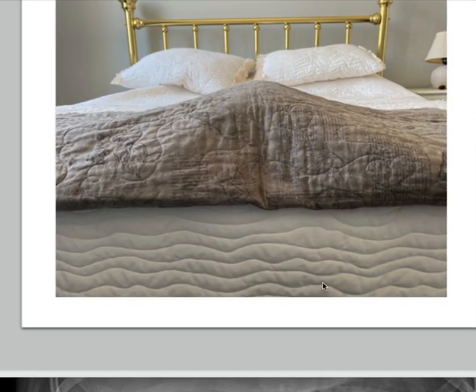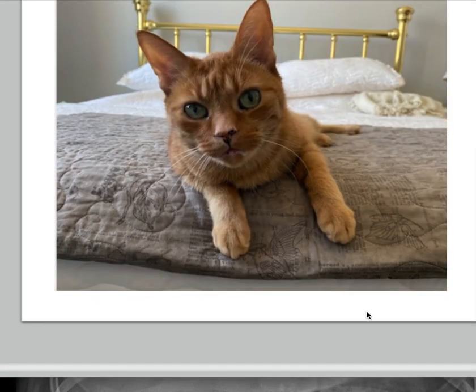For those of you whose cats prefer to sit on top of the bed, this is what it looks like. You can see that the edge of Mac's body and the edge of the bed now create a sharp margin.